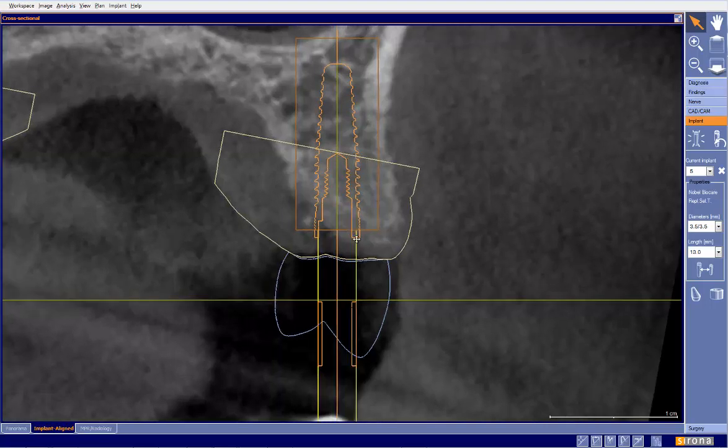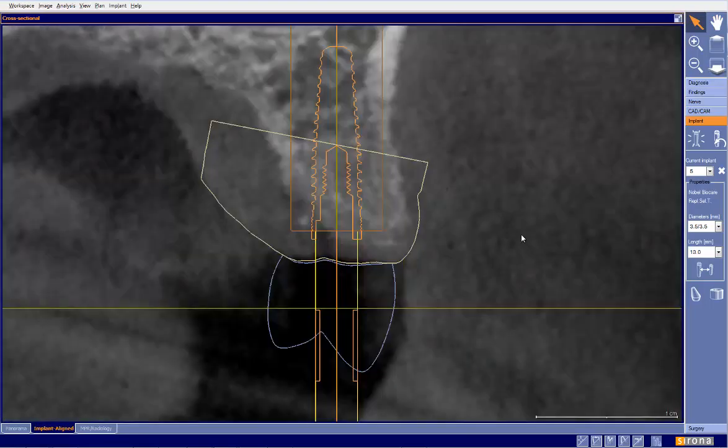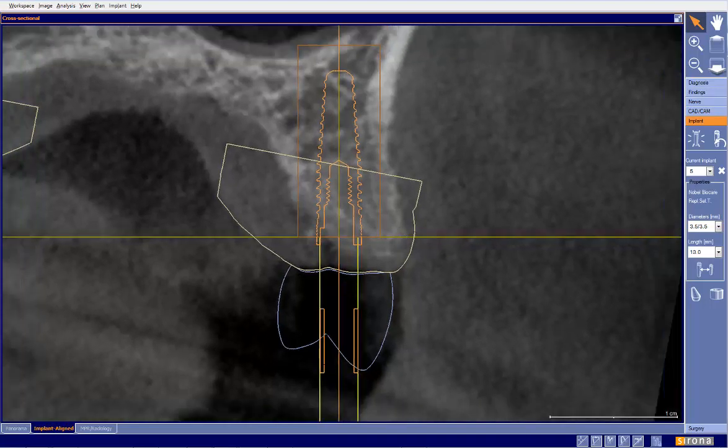Bone level looks very good here. Here we're at the level of the bone. That should be pretty straightforward. The only thing I would take into consideration, and I don't know the history of this tooth, is the emergence profile. In other words, are we going to have enough room from the head of the implant to emerge out? It's cutting it close, but it's possible there. So if anything, I would maybe place this implant a hair deeper to allow a little bit more emergence profile like that. So, room for developing the ideal emergence.